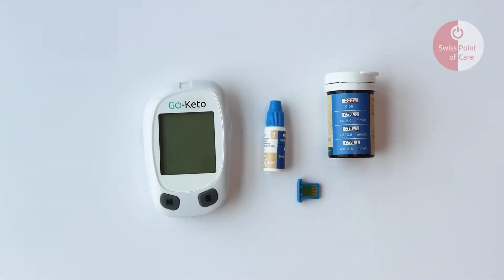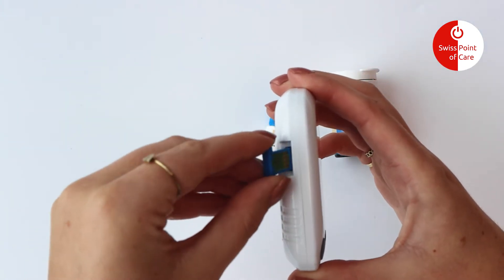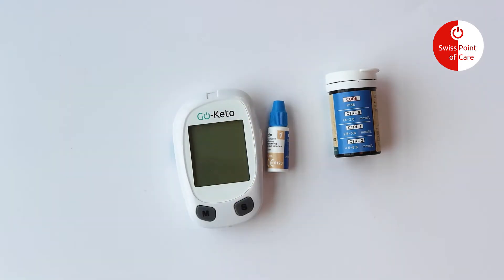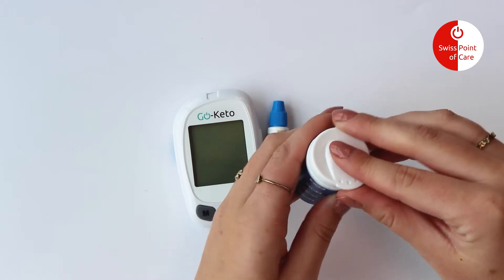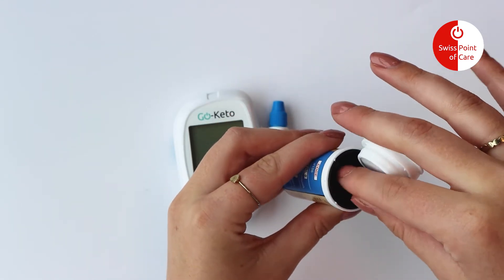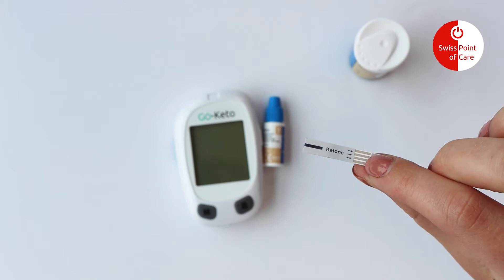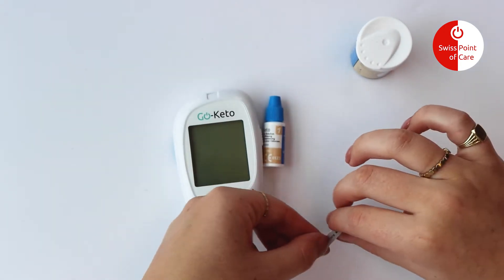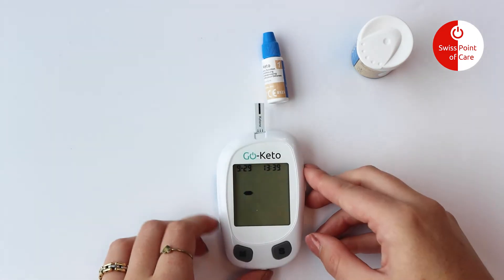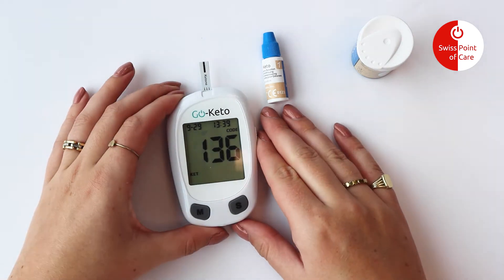Performing a quality control test. With the meter off, insert the code chip into the code chip slot. Insert a test strip into the strip port to turn the meter on and check the display. Make sure the code number that appears on the display matches the code number on the test strip vial or on the foil pouch.